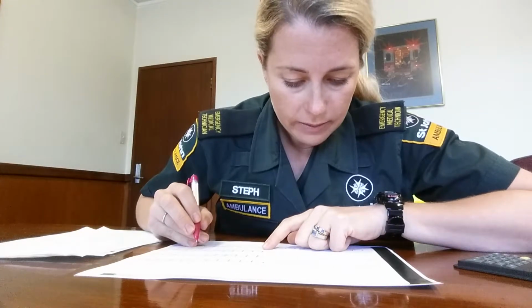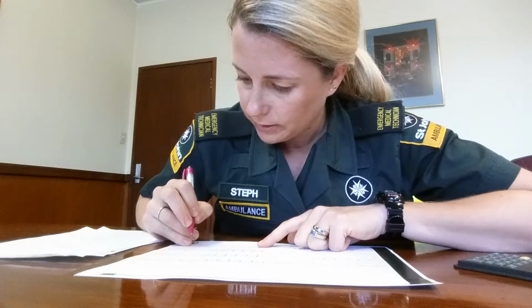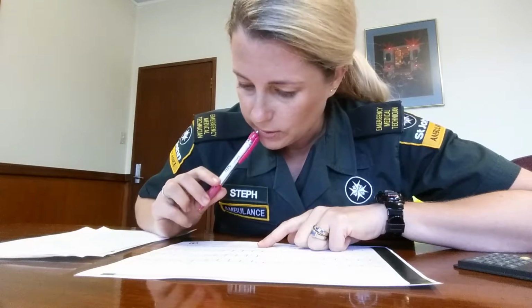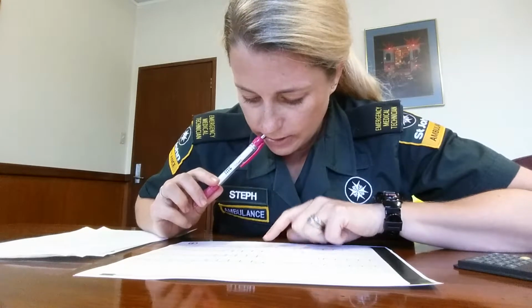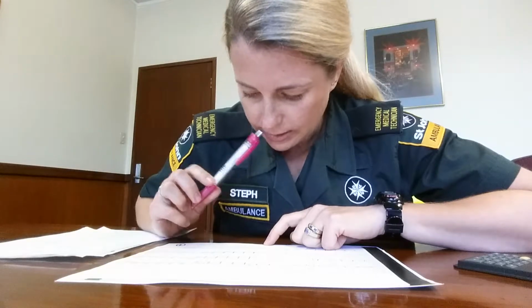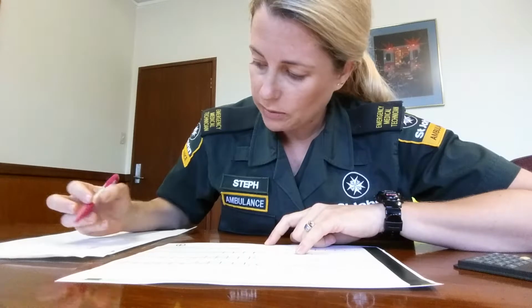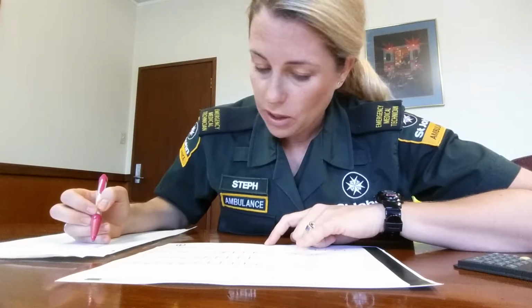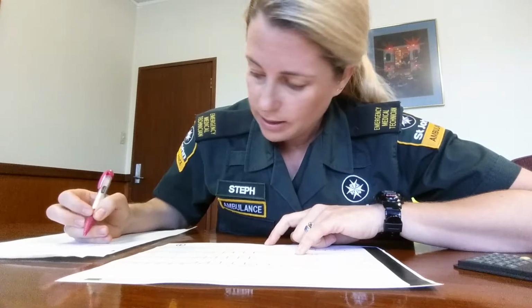And then the T waves, they should be asymmetrical, and they should be positive, and they shouldn't be more than 2/3 the height of the R wave, which they're a bit peaky, a bit high, so we're definitely seeing some signs of changes there. As for the morphology, we've got no wide QRS. We don't have any bundle branch blocks.